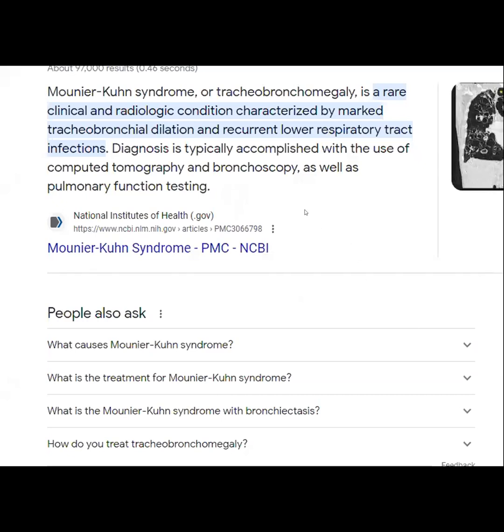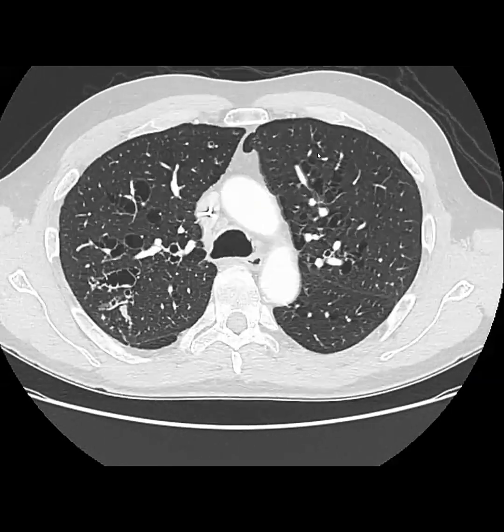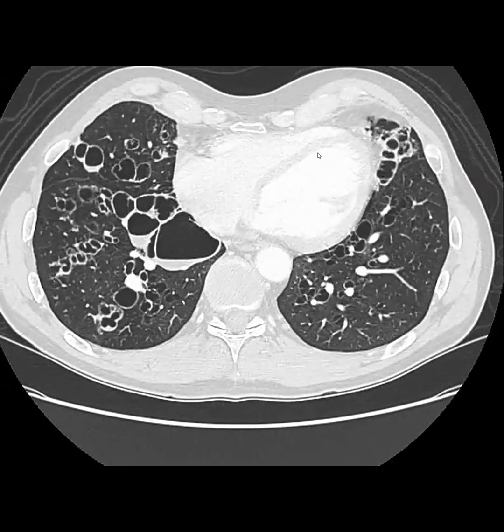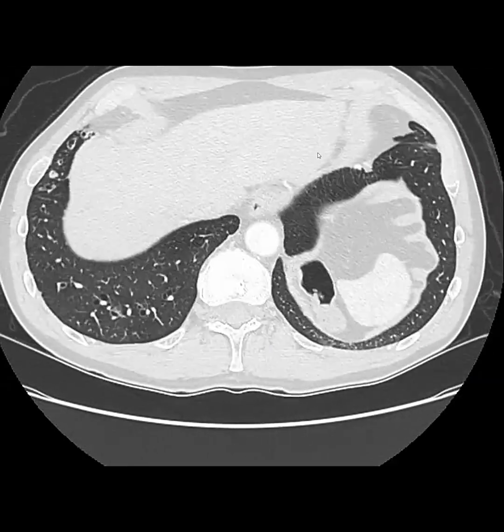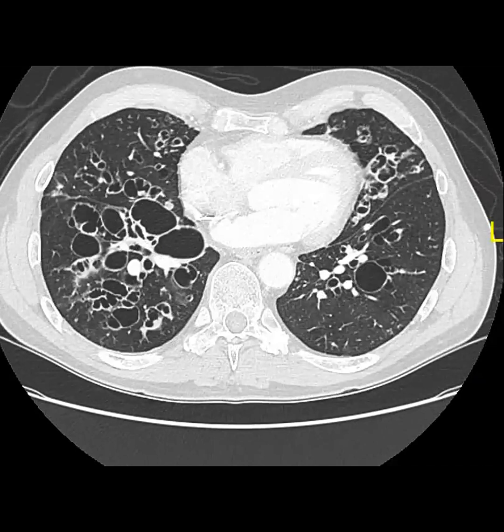This patient has a standing diagnosis of Mounier-Khün syndrome, which is a rare clinical-radiologic condition characterized by marked tracheobronchial dilatation and recurrent lower respiratory tract infections. This wasn't why the patient was scanned — the patient has a history of TCC and this is a surveillance scan. But I've never seen this in real life, so I figured I'd show you, even though it's not a chest conference.